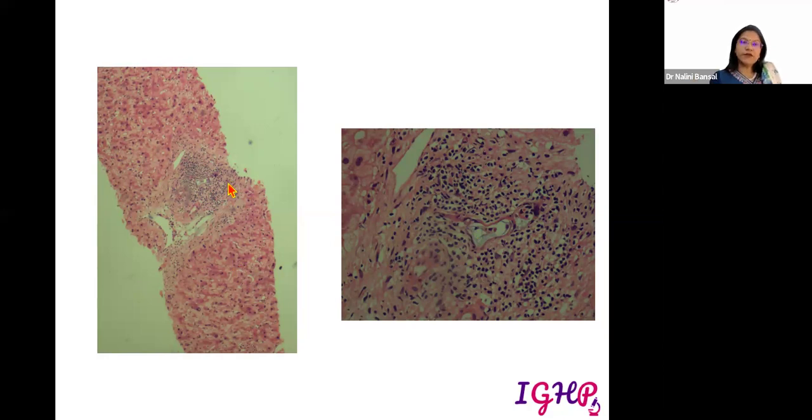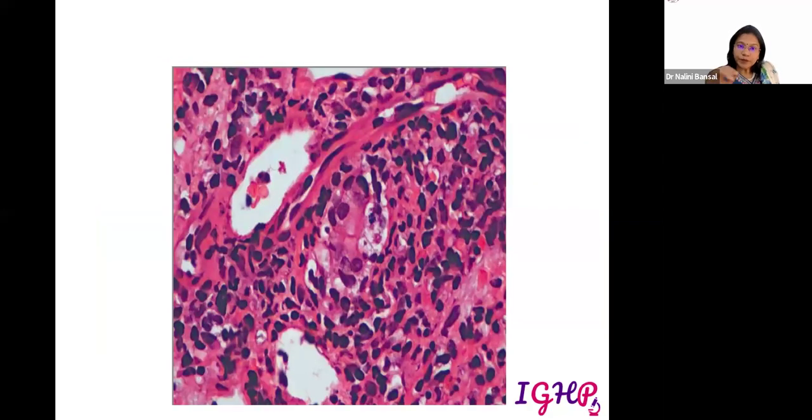So this again is liver tissue, and here we are finding a moderate degree of rejection with degenerative changes of the ductal tissue. Here again we are finding a duct, and in this duct it is difficult to identify the duct lumen. We are finding a portal vein here, some venous profile. These are the venous walls. There is a mixed inflammatory infiltrate, and here we have got a bile duct.